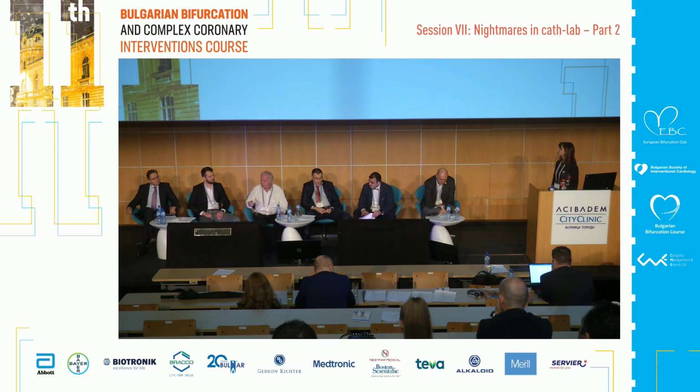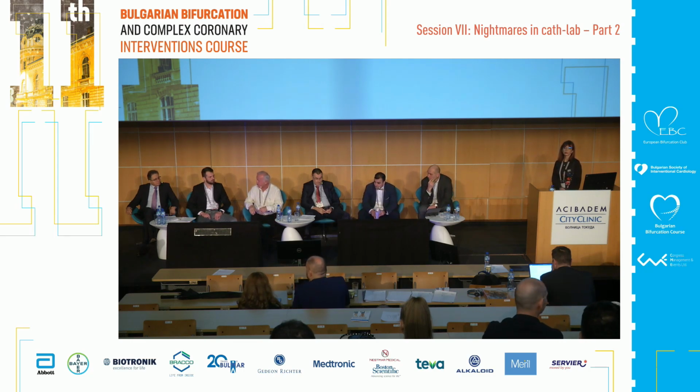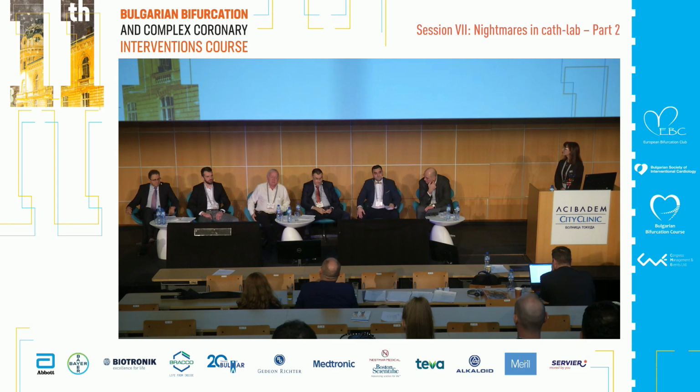But we had in Massy, we share with my friend Thierry, my patient, a lady who was 103. She was treated on a proximal lesion on the LAD, received TAVI, and she died at 108. Can I have a comment? Excuse me. I think the good option is to treat the severe proximal lesion before the procedure.